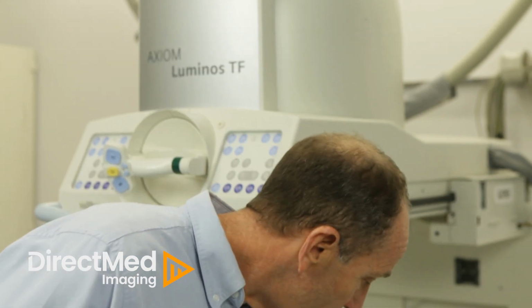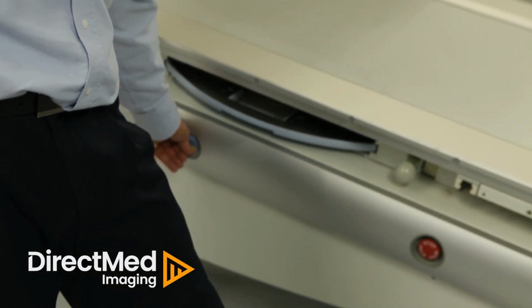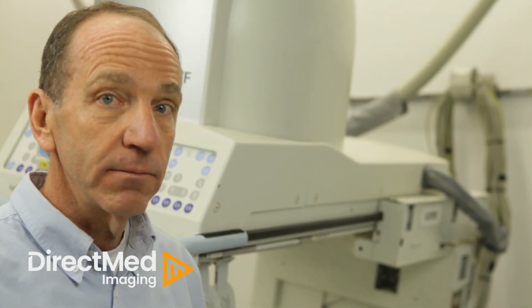Today, we'll be talking about the park positions for the overhead tube assembly. You might get a service call for the table not moving to the full 90-degree position. The most common cause of this issue is the overhead tube not being in the park position.